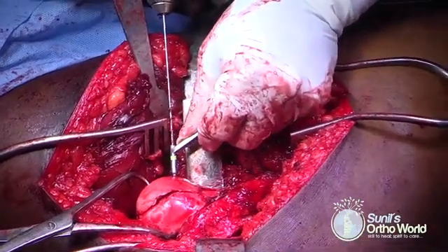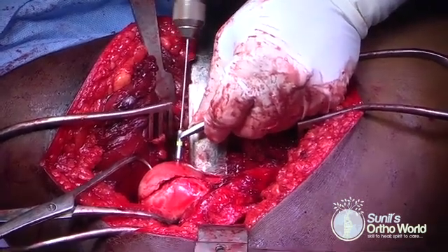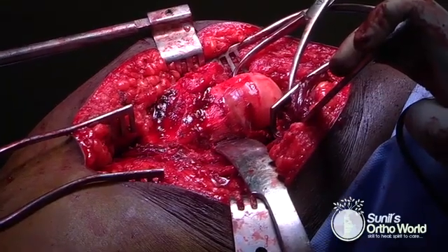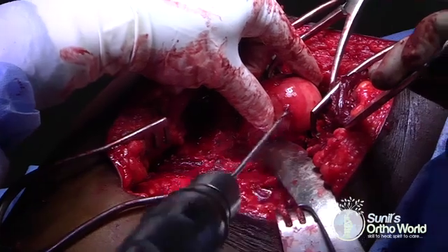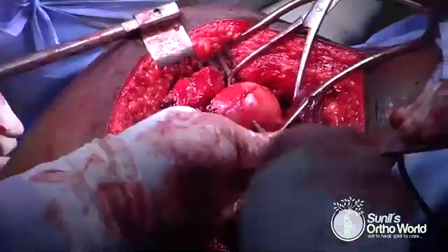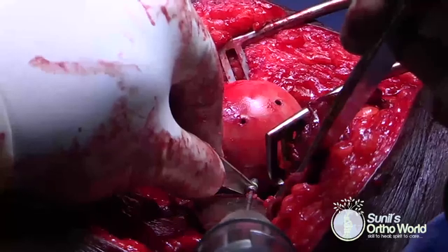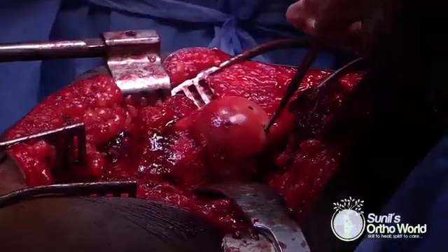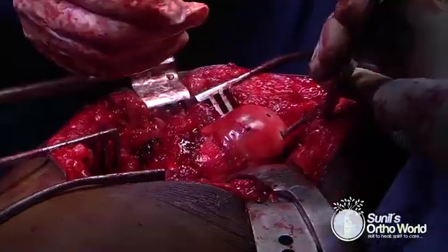We prefer to use 2.4 mm countersunk cortex screws for fixation. Whenever possible, we prefer to drill from the antero-inferior portion of the femoral head. Brisk back bleeding from the fractured fragment indicates viability. The near cortex is slightly overdrilled to help in countersinking, and a 2.4 mm cortex screw is inserted and countersunk. The comminuted antero-inferior fragment is fixed using a similar technique, and fixation is completed by placing two more screws into the main fragment. The mark made by the prongs of the Weber clamp is used to insert the final screw.